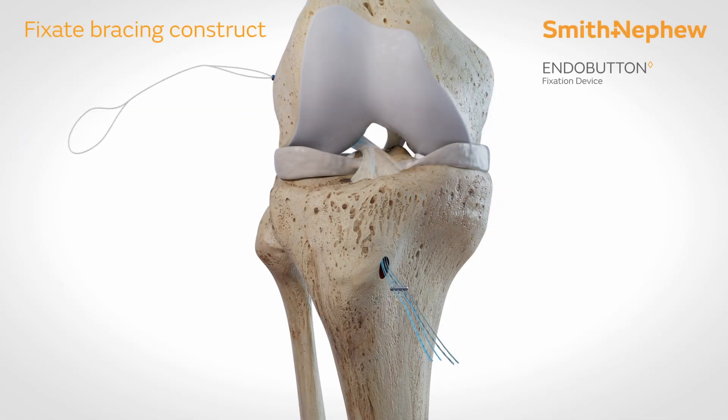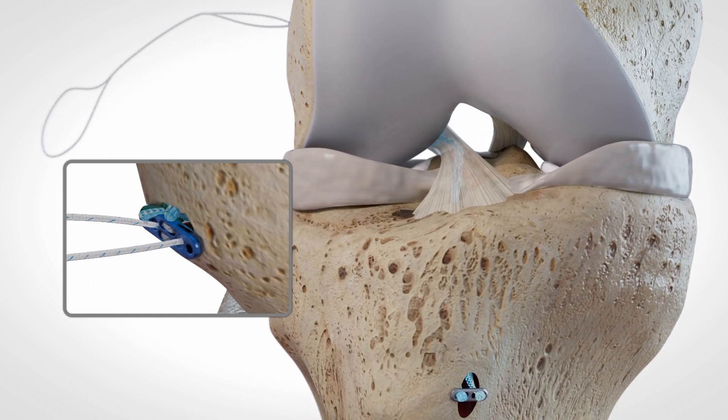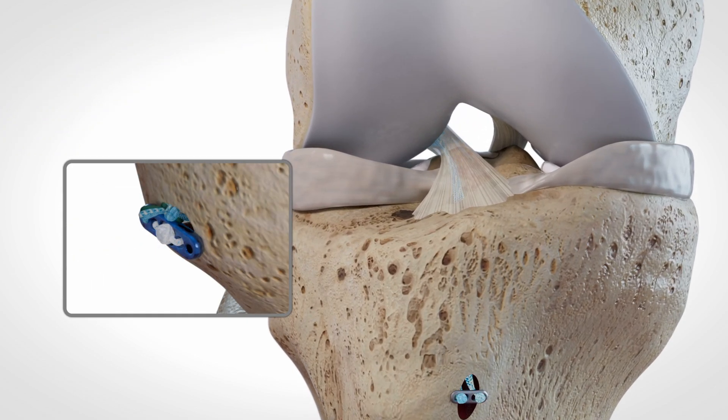With the leg in extension, tie the ultra-tapes to an endo-button for tibial fixation. Assess tension and fine-tune as needed with the ultra-button.